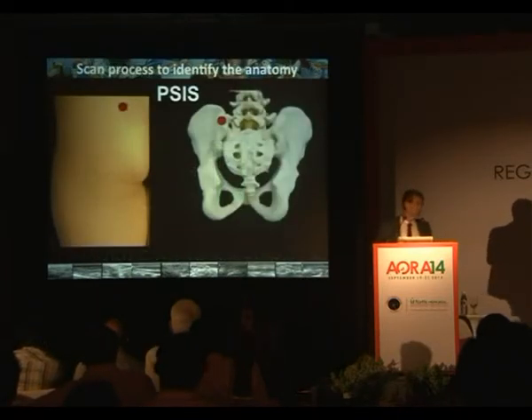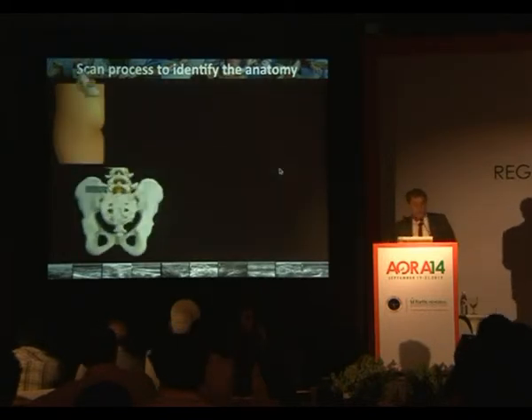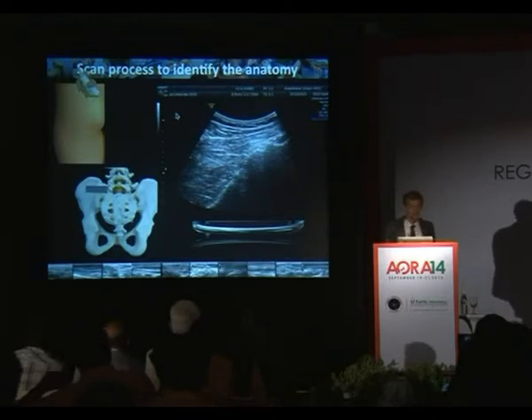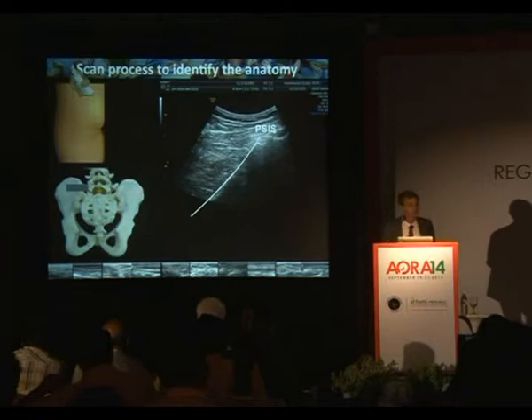So we're going to start, and everybody is able to recognize the posterior superior iliac spine, and if you have an obese patient, the ultrasound will tell you where the posterior superior iliac spine is. It's very easy. It is a bone landmark, a little mountain with a slope, which is the ilium. You just put your probe at this place, you will see the posterior superior iliac spine, easy to identify, and you will see this slope, which is the ilium.